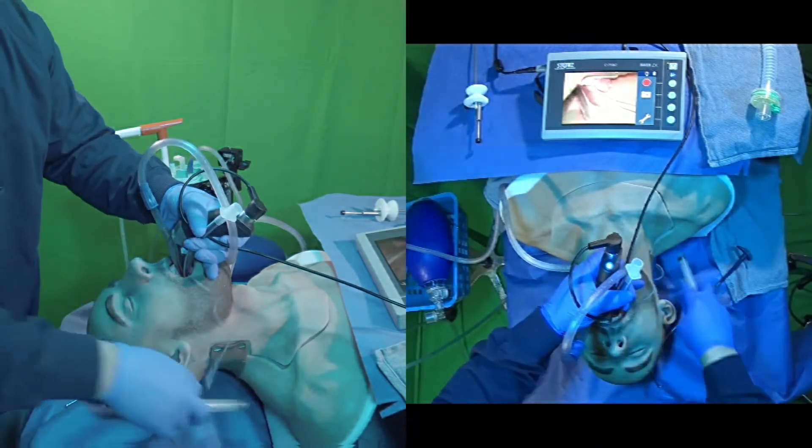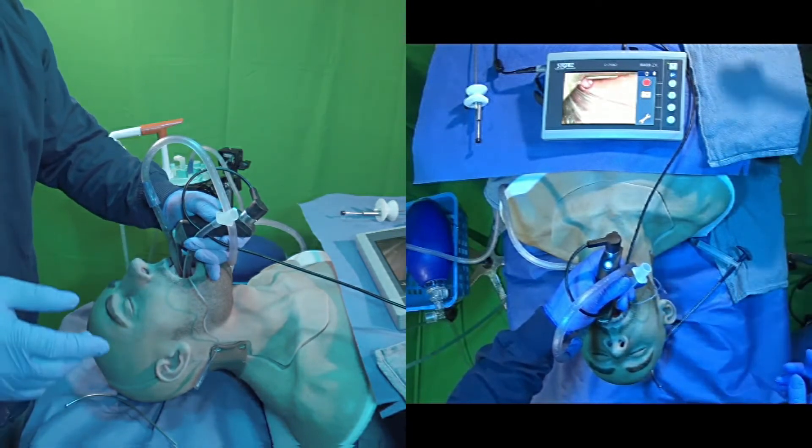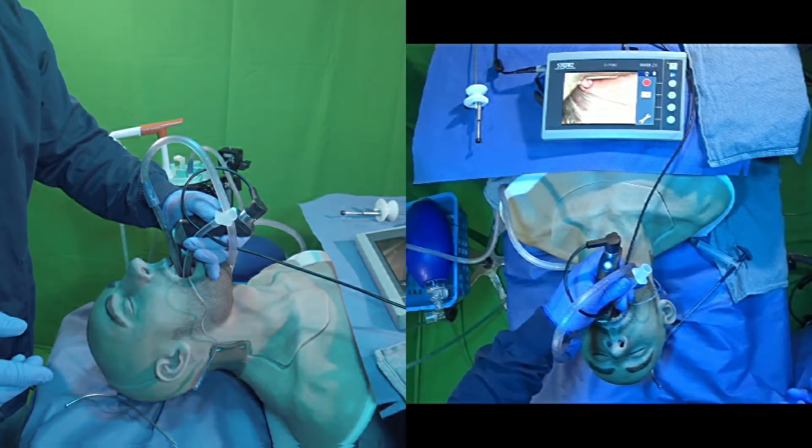Now, we know that the airway was soiled when we started, so we have to assume that some of the aspirate probably made its way down into the trachea.